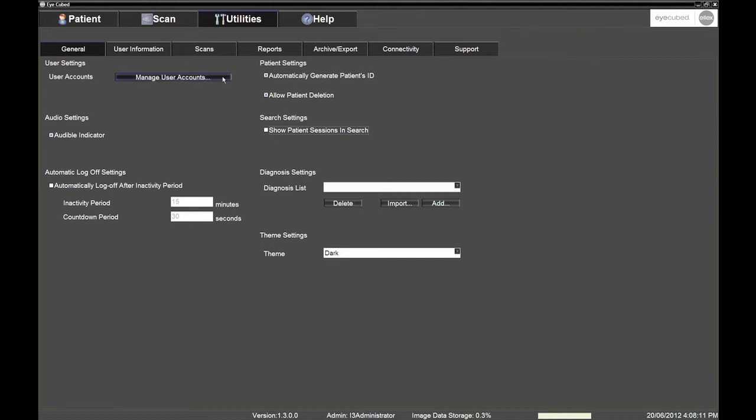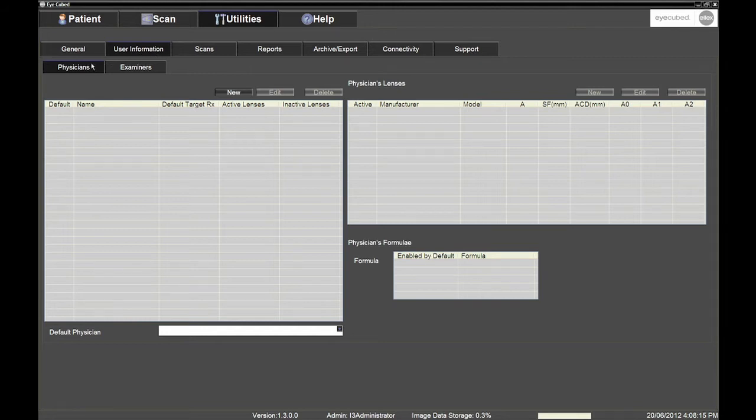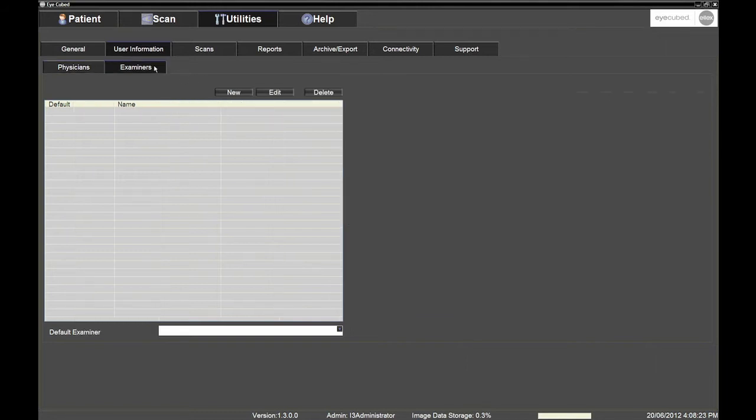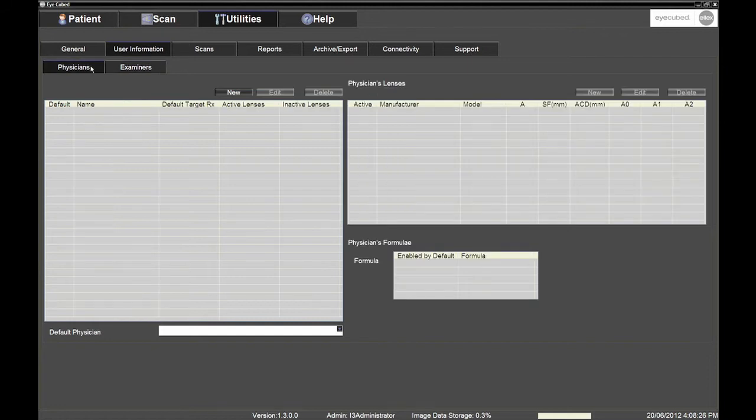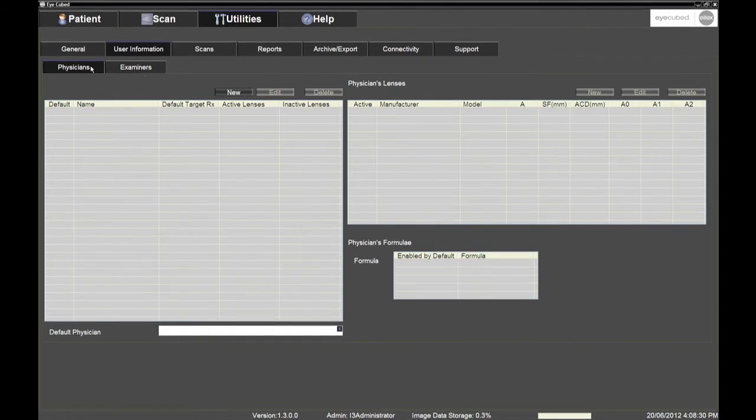Move to the User Information sub-tab in order to enter the Physician and Examiner related information. The Physician will be linked to the IOL files whilst the examiner will be the doctor or the technician performing the actual examination. For the Physician section, we recommend entering one single name, ideally the name of the clinic or of the hospital, to which all IOL files will be linked. This will avoid the need to re-enter the IOL data several times.